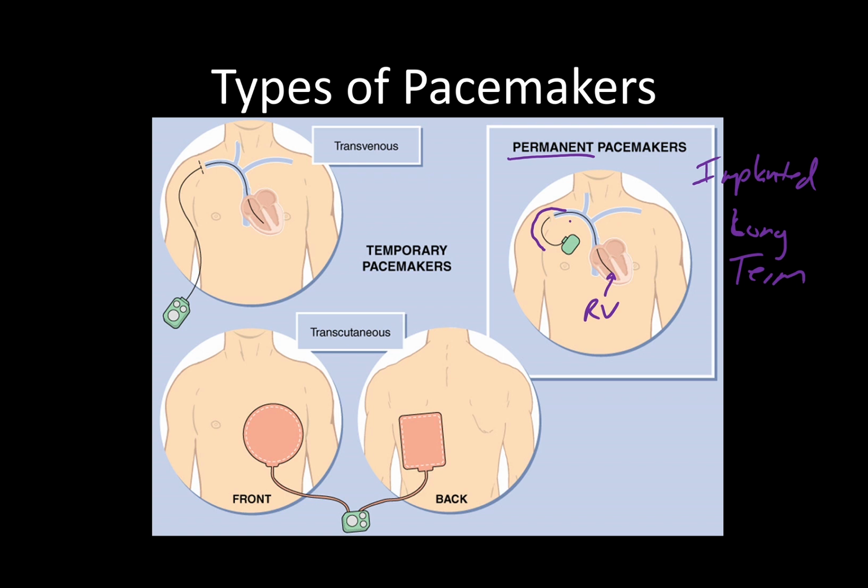Now, on the other side, we have our temporary pacemakers, and there's 2 subsets for that. The one that you've probably seen or heard the most about is going to be your transcutaneous.